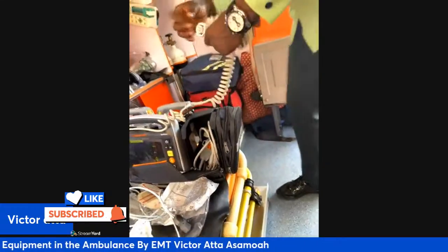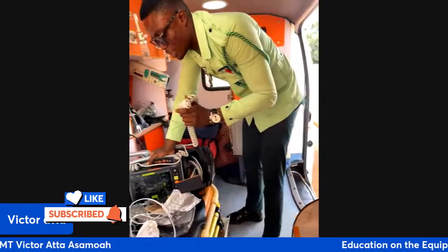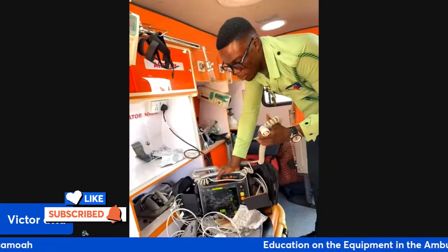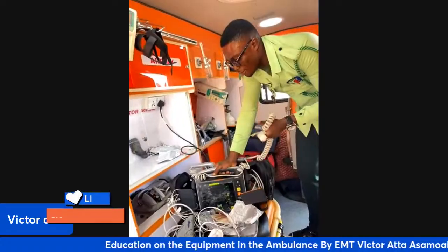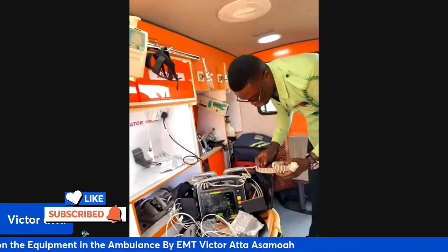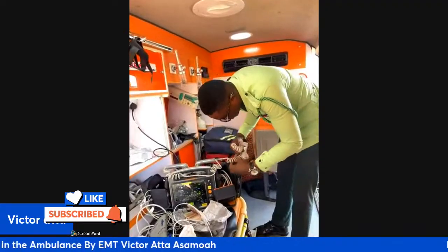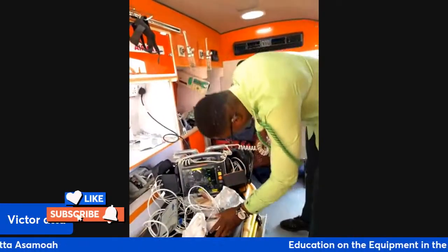But when you are using this machine, you should be very, very careful. It can take your life. When you are trying to revive someone, the person might be revived, but you can get shocked. So when you are using this machine, you should be extra careful. And we have the ECG.